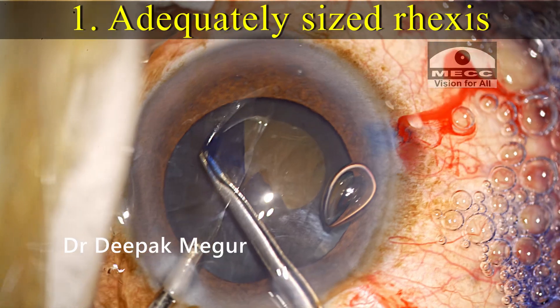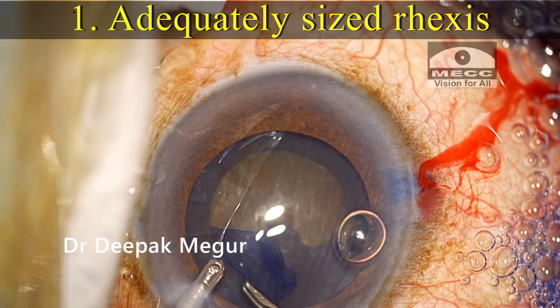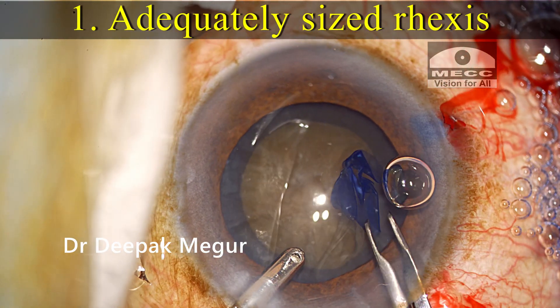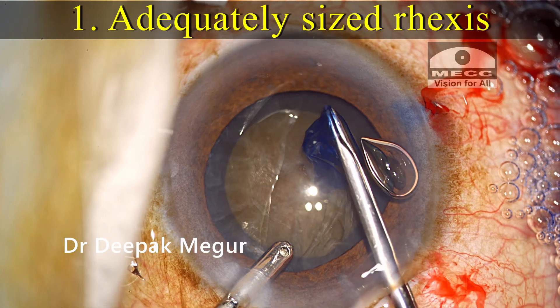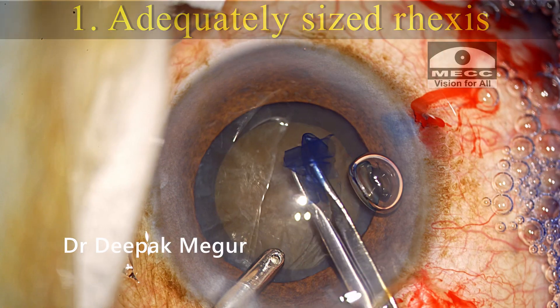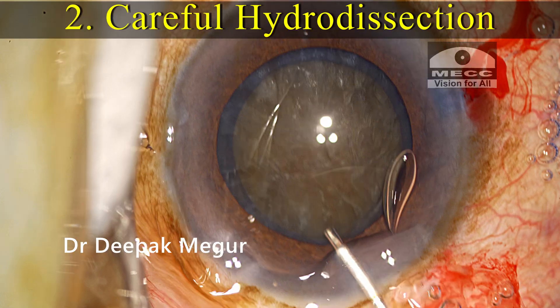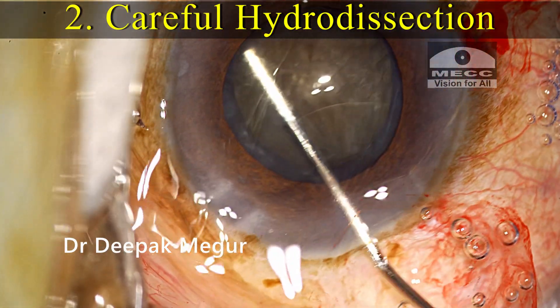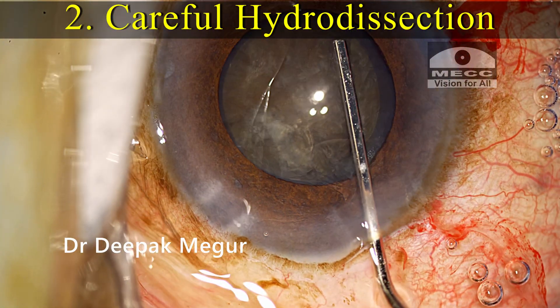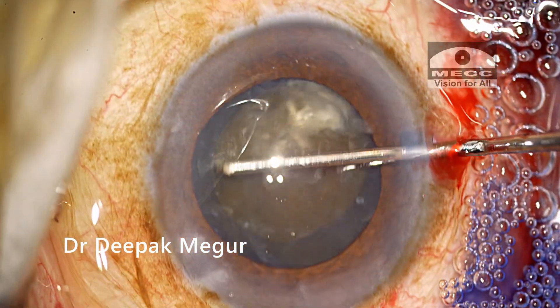A few precautions are to be taken. Number one: an adequately sized rhexis — this is very critical, as a larger rhexis makes it easier to manipulate the nucleus, putting less stress on the capsule and zonules. The rhexis here is around 5mm, but ideally 5.5mm. Number two: during hydrodissection, use a very limited amount of fluid to prevent posterior capsular blowout, as some cases have very thin posterior capsule. Free nucleus rotation confirms the lack of corticocapsular adhesions.